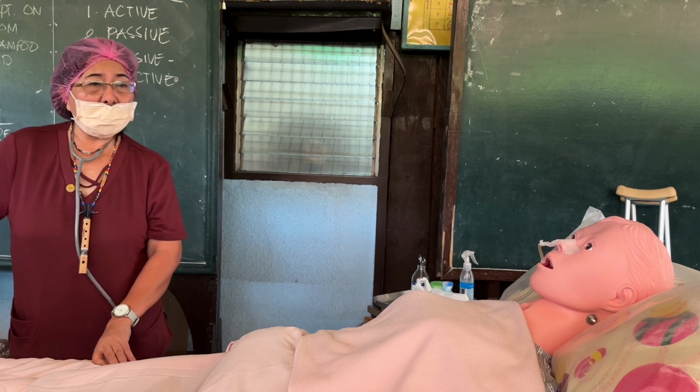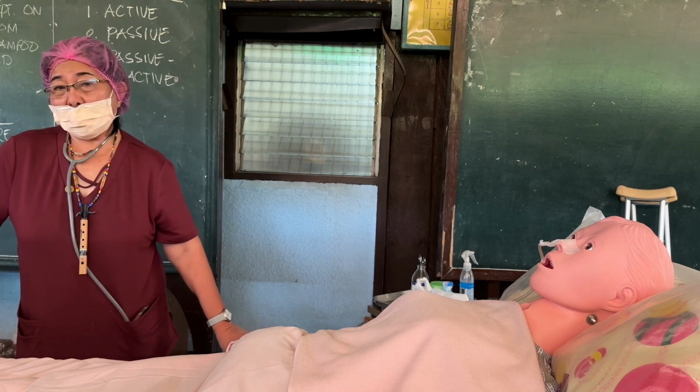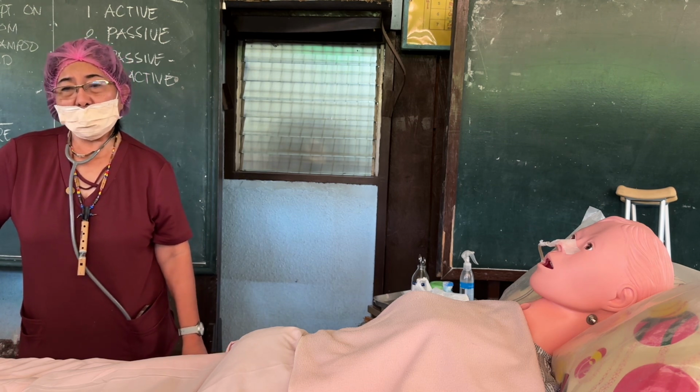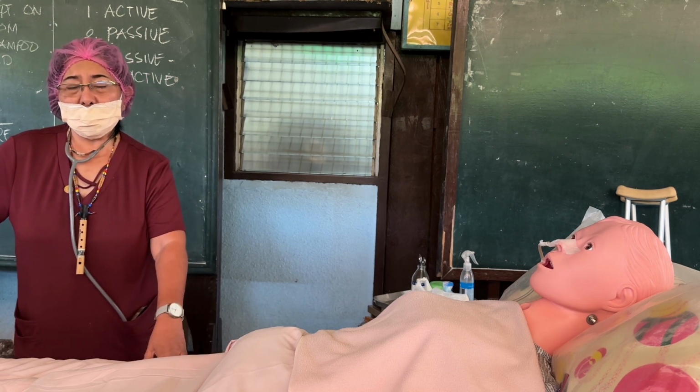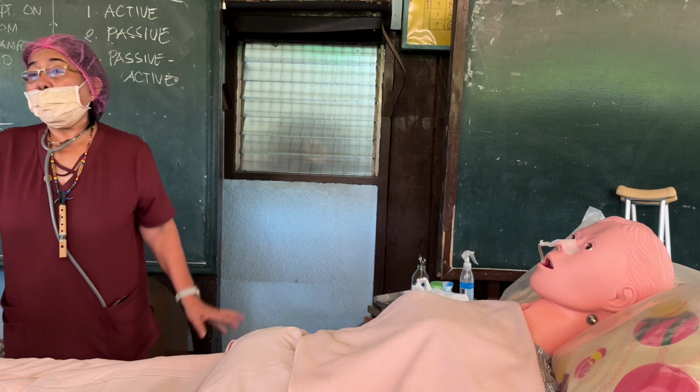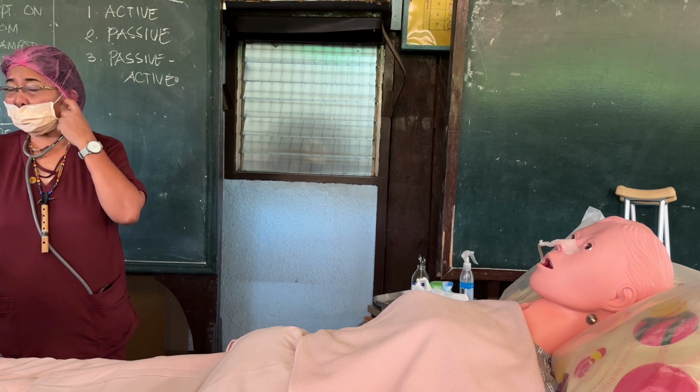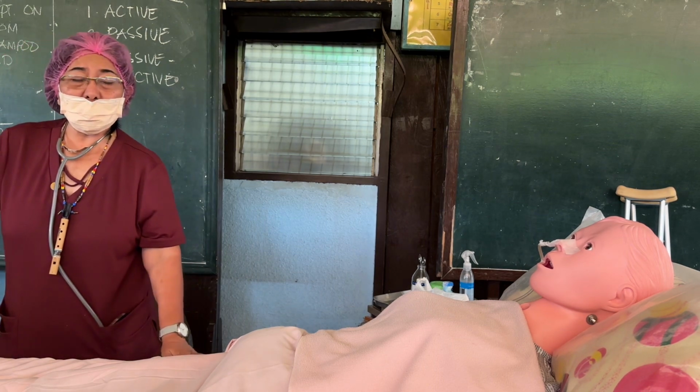The smell is very offensive, so you have to seal it. Do not throw it away unless the doctor has already examined the content. What do you think is the content of the gastric drainage?